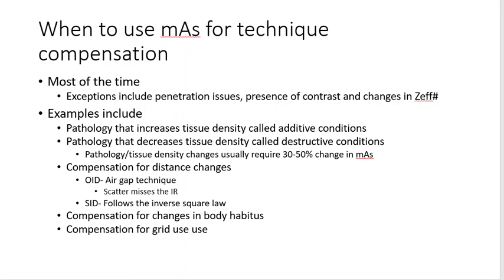The first patient of the day that you made an exposure on was of a sthenic type body habitus, and you had a good technique for that. Your next patient that came in more closely represented a hypersthenic because maybe they were third trimester pregnant, and you need to make an exposure on that. Well, would you increase mAs or would you increase kVp? Well, even though it's not ideal, you might increase kVp.